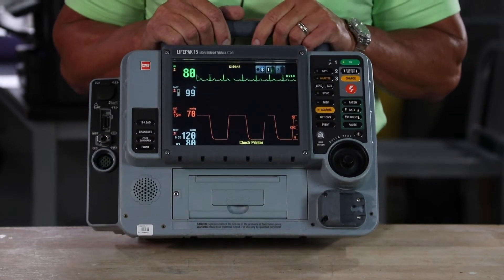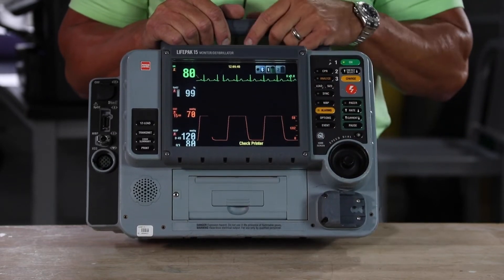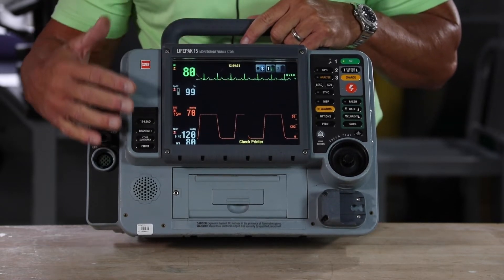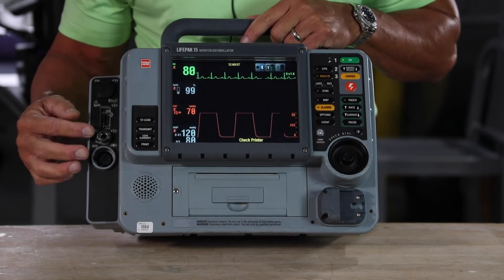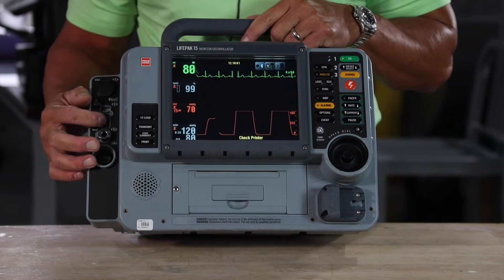Everything that we give the patient as far as electrical therapy is on this side of the device. Everything that we get back from the patient as far as monitoring capabilities is on this side. So here's your 12-lead, here's your NIBP, your end-tidal CO2, and your SPO2 connection here.